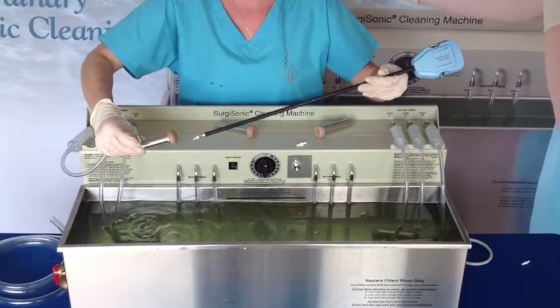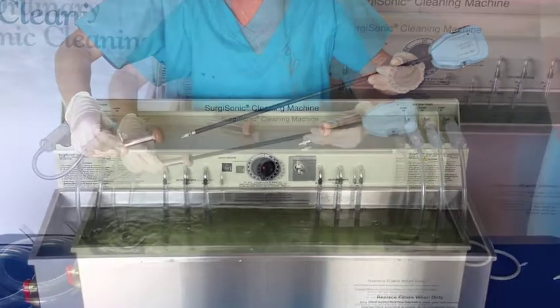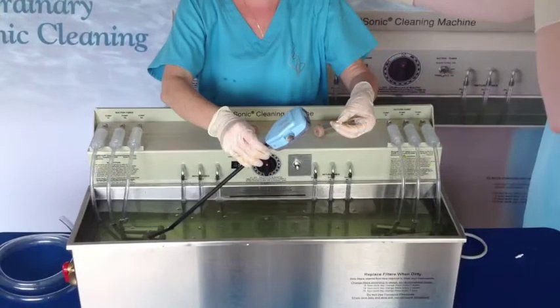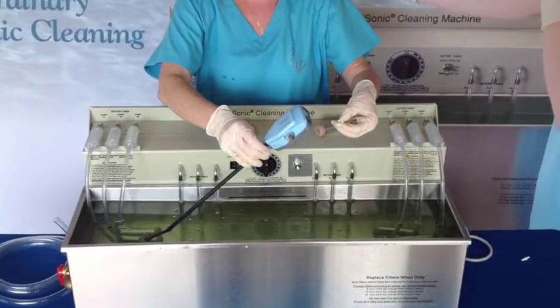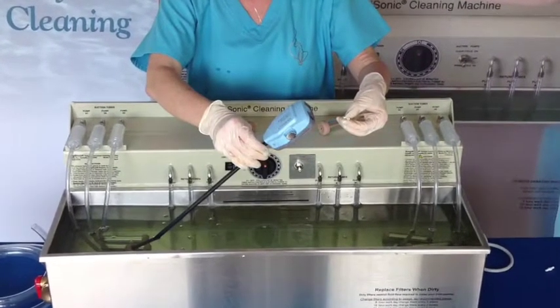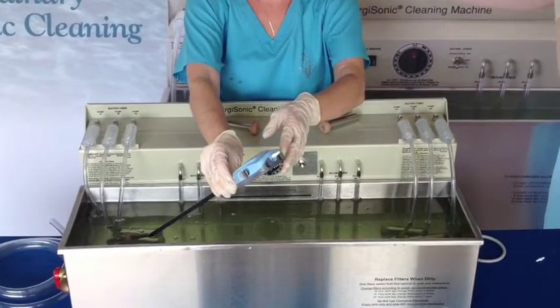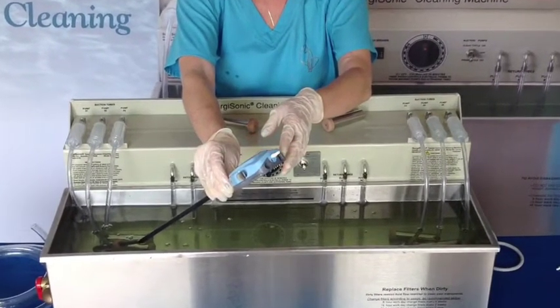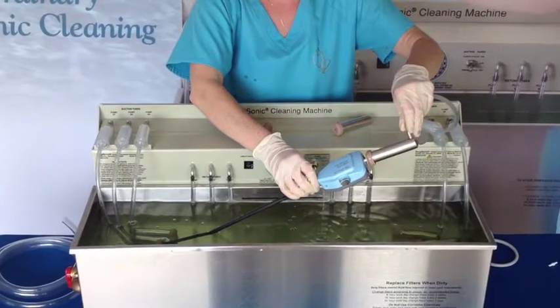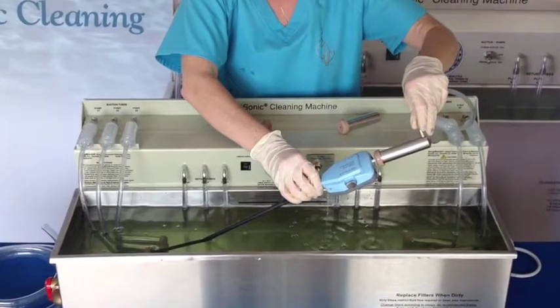Instrument Installation Left Side: 5. Insert the entire jaw pulley area of the DaVinci robotic instrument into the Surgi Scrub scrubbing chamber. Instrument Installation Right Side: 5. Insert one end of the male-to-male lure slip connector into the No. 2 output hole of the DaVinci control box. 6. Insert the other end of the male-to-male lure slip connector into the medium hole rubber nipple that has been fitted onto the Surgi Suction Chamber.